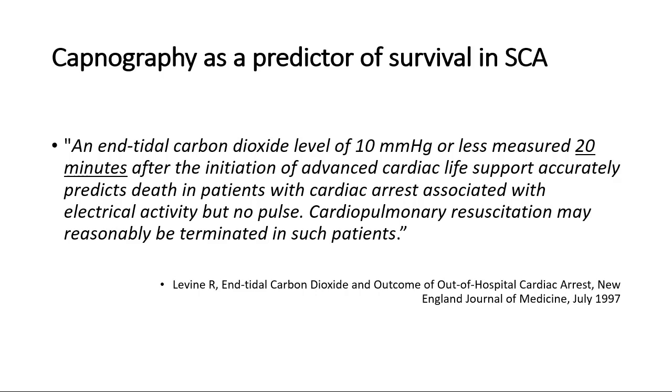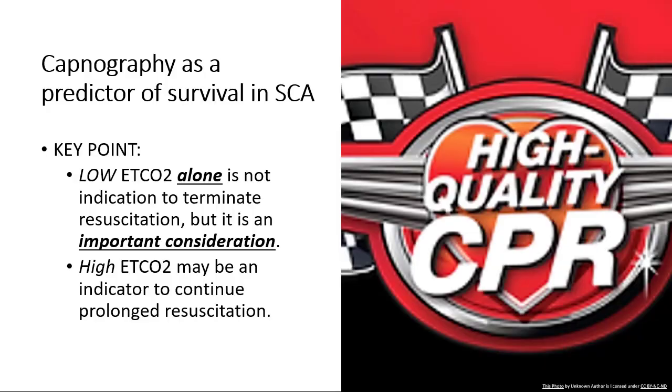So what does that mean? Does that mean if you take the study at face value, you think, okay, well, I'll work them 20 minutes, and if their end-tidal CO2 is still less than 10, I can call it? Yes and no. This is what I say: it is probably a very important parameter, but I still look at other factors. I'm really reluctant to base any high-stakes decision on one single parameter, but it's an important assessment. Low end-tidal CO2 alone is not an indication to terminate resuscitation, but it's an important consideration.